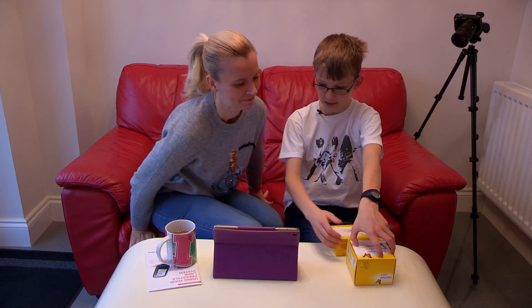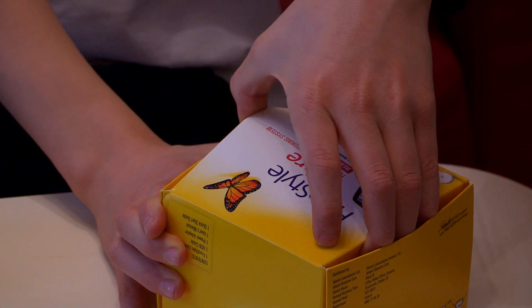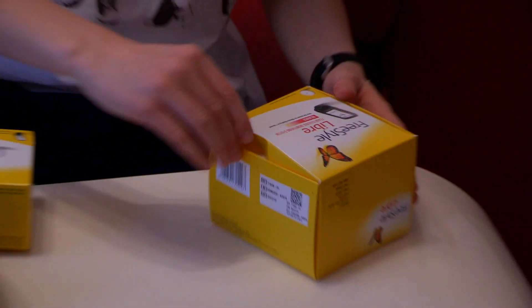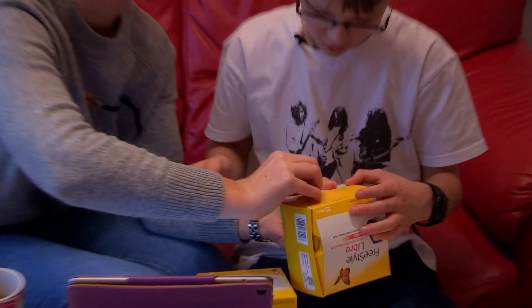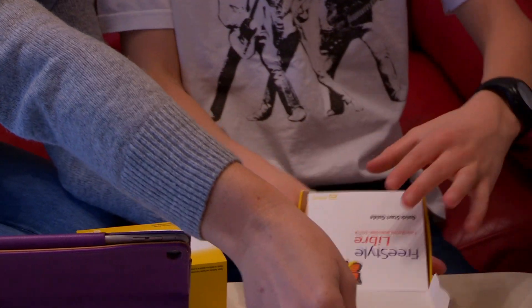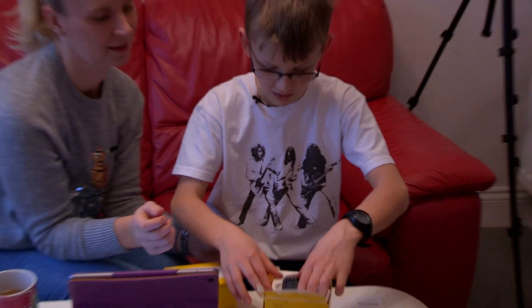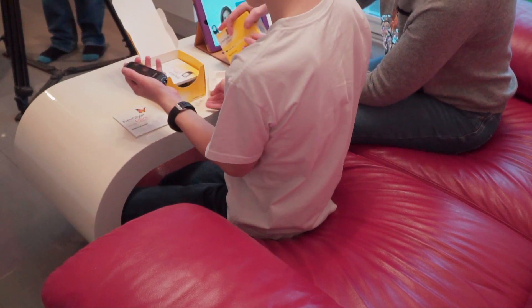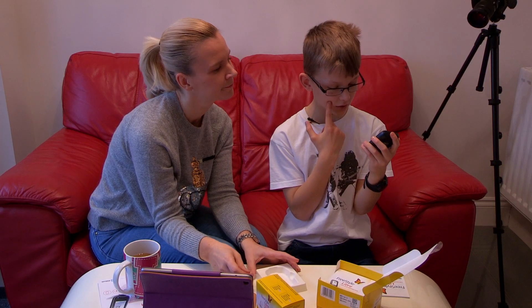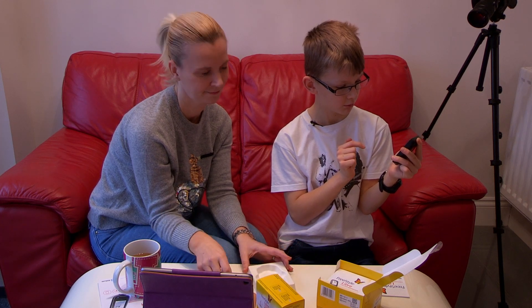We're going to unbox this. Make sure you look on the website for tutorials if you forget. So inside you'll have the quick start guide, and this is the reader.